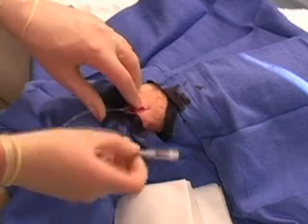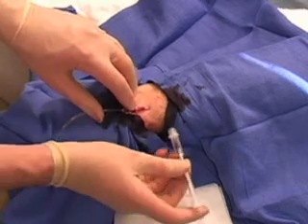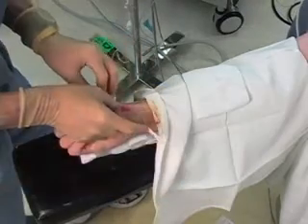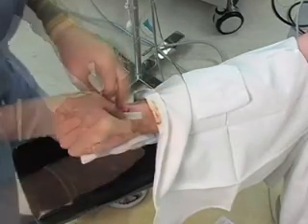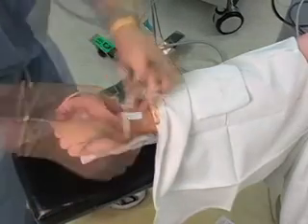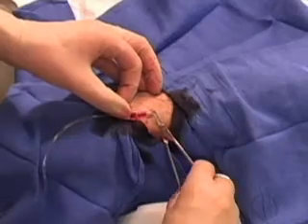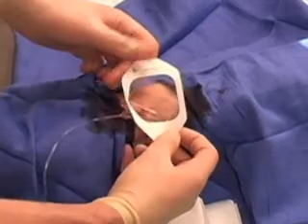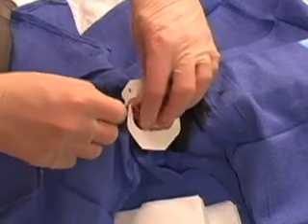Regardless of the technique used to place the catheter, great care should be taken to make sure it stays in place. Although there are ways to secure the catheter with adhesive tape, the best way to secure the catheter is by suturing it in place. A moderate diameter non-absorbable suture material such as silk or nylon should be used.